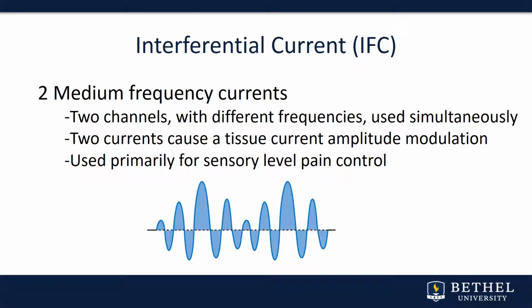So hope that helps clarify some things, and remember that you need to memorize those parameters for pain control. There's 2 sets of parameters, and for muscle contraction, there's really only 1 set of parameters, and we can adjust the duty cycle.